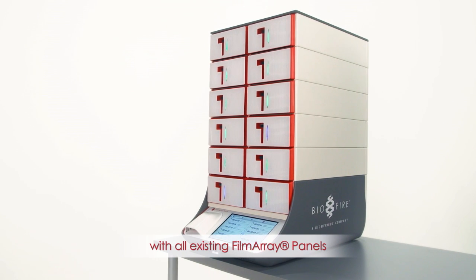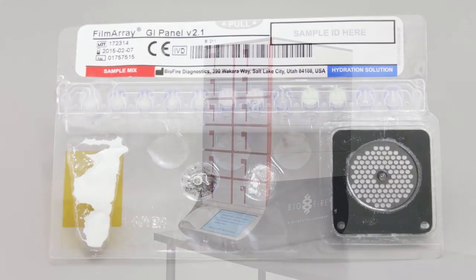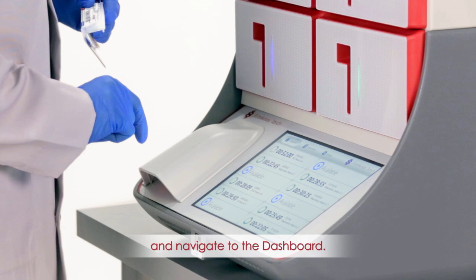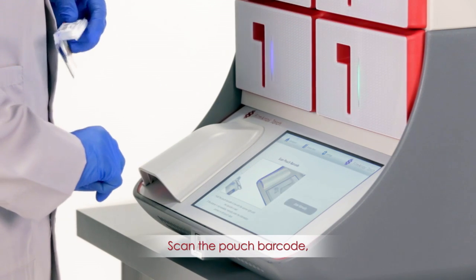Performing a run. The FilmArray Torch is compatible with all existing FilmArray panels and uses the FilmArray pouch to run tests. To start a run, use the touchscreen and navigate to the dashboard. At the dashboard, select an available FilmArray Torch module to perform the run. Only FilmArray Torch modules in an available state can be selected to start a run. Scan the pouch barcode.